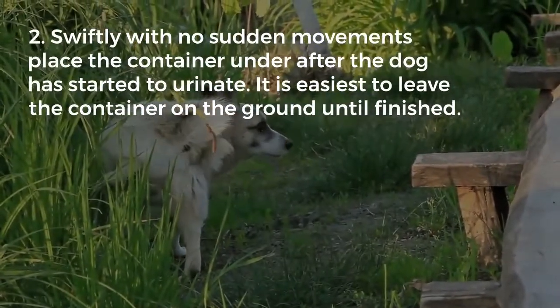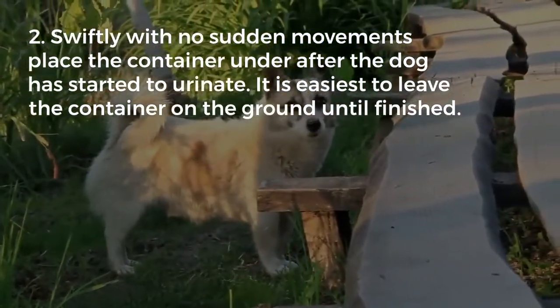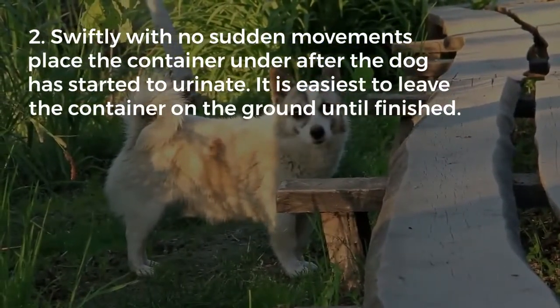Second, swiftly, with no sudden movements, place the container under the dog after they have started to urinate. It is easiest to leave the container on the ground until finished.